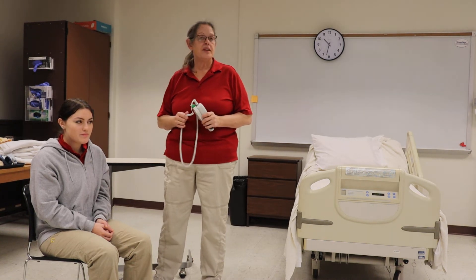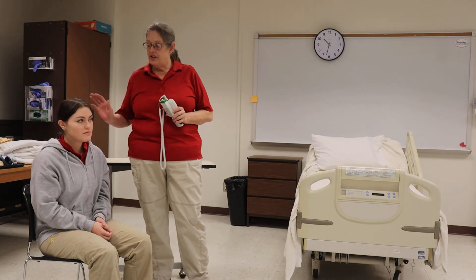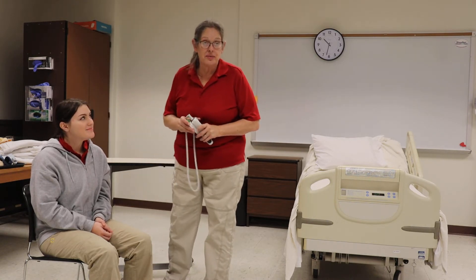Hello, this is Mrs. Burnfield. We're getting ready to do RCP number 13, which is axillary temperature. So that I don't embarrass my student, I'm just going to talk you through this one.